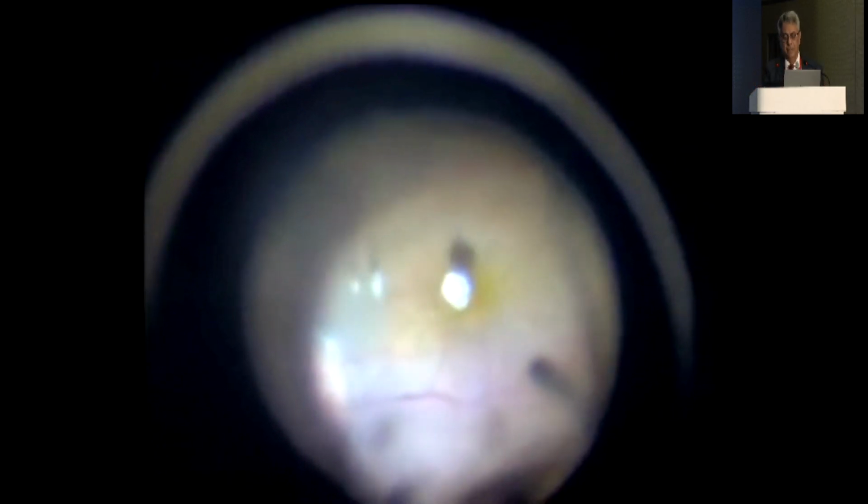So in such situations, as Dr. Bhuvan was saying, we do a foveal sparing PVD induction, meaning you go round and round after you have separated the plane. Then don't pull at the fovea, and leave a small island as is being shown here. We trim all around, but this small stump is allowed to remain there. And then you complete the peripheral vitrectomy and inject air only.